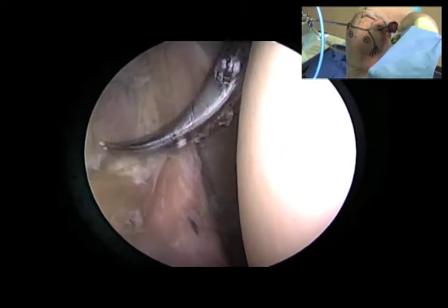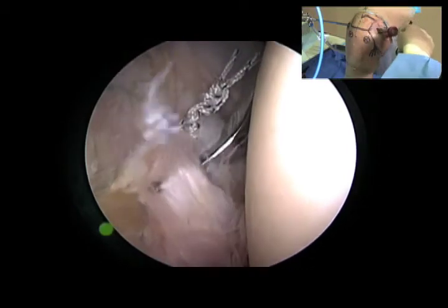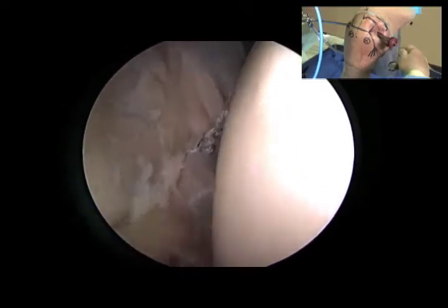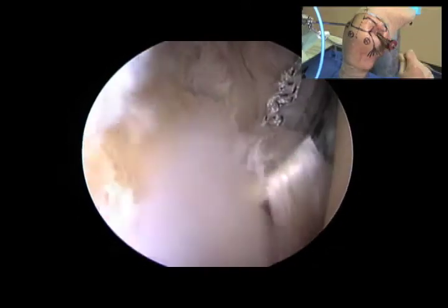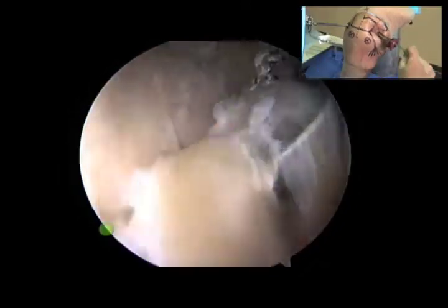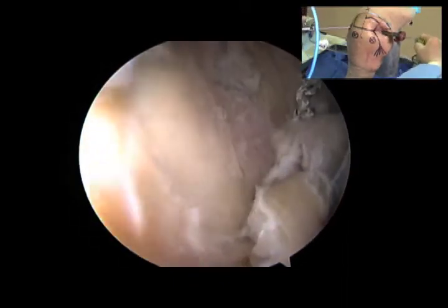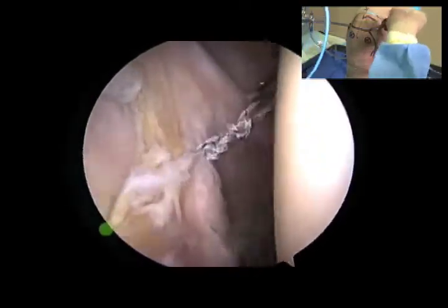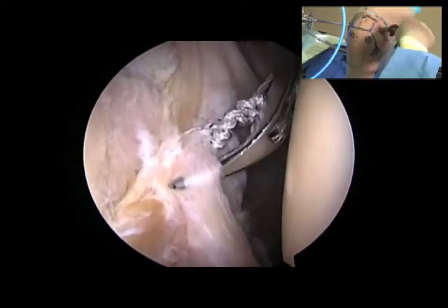As the jaw opens on the posterior aspect, we can pass through the inferior glenohumeral ligament and then pass through the labrum to create a beautiful passage at the six o'clock position. Now we see how the device has nicely passed at the six o'clock position, but in order to demonstrate the retrieval of tissue, we'll show just passage through the labrum itself.